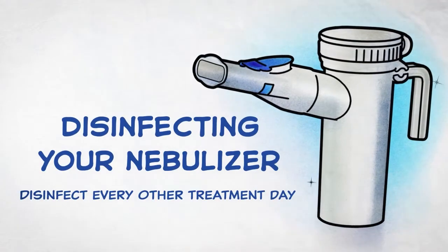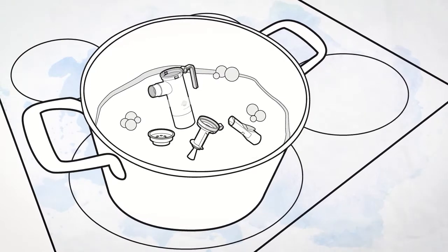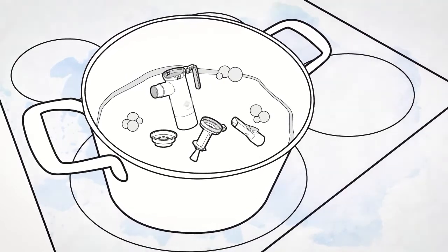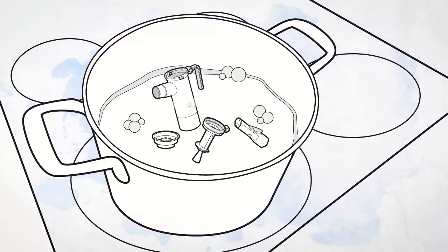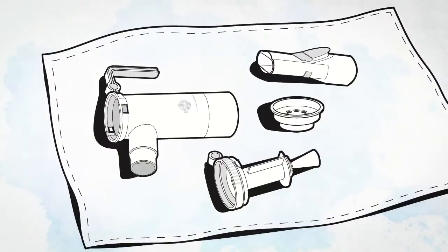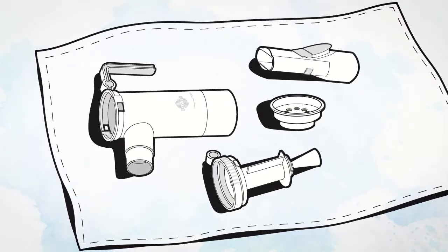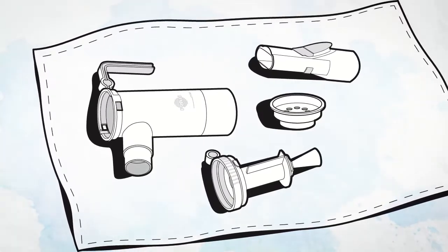Disinfecting your PARI Reusable Nebulizer: The PARI Reusable Nebulizer parts, except tubing and mask, can be disinfected by boiling them in a clean pot of water for a full 5 minutes. Dry parts on a clean, lint-free cloth. It only takes a few extra minutes to keep your PARI Reusable Nebulizer working properly.